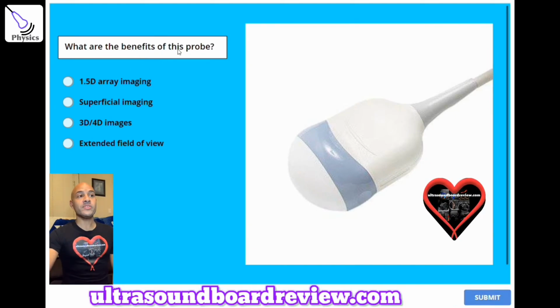Question number 6. What are the benefits of this probe? A. 1.5D array imaging. B. Superficial imaging. C. 3D 4D images. Or D. Extended field of view. The answer is C. 3D 4D images.